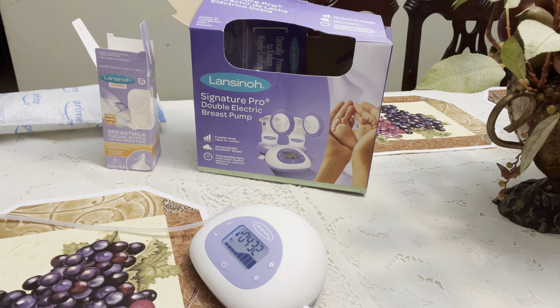This breast pump is still priced under a hundred dollars. For any mother who's a first-time mom still learning and asking questions — if you're going to spend out of pocket, you do not want to waste your money. A hundred dollars can go a long way if you're going to buy something that's not working for you. Right now it's pumping but it still hasn't yielded any noticeable output so far, not even on the app.